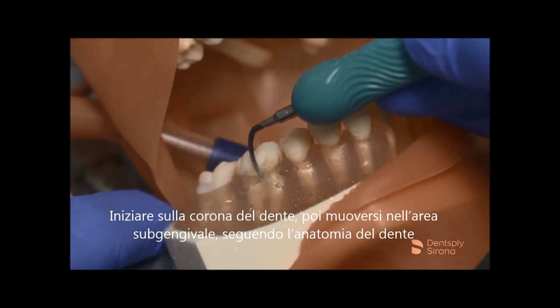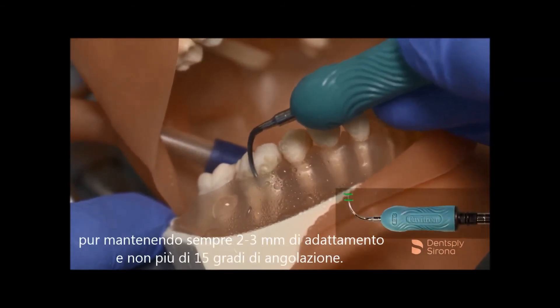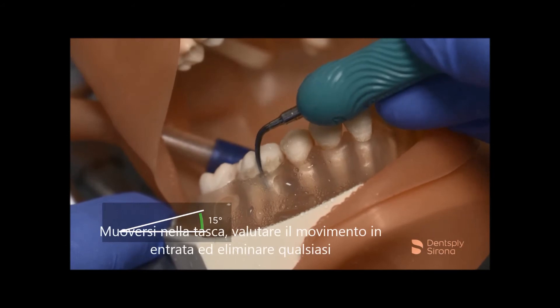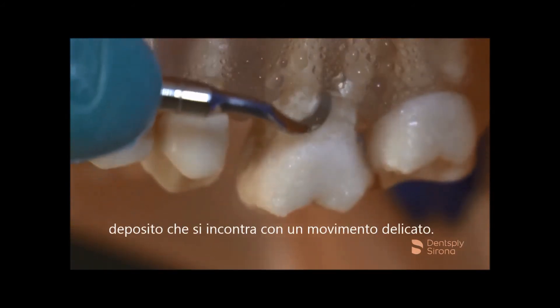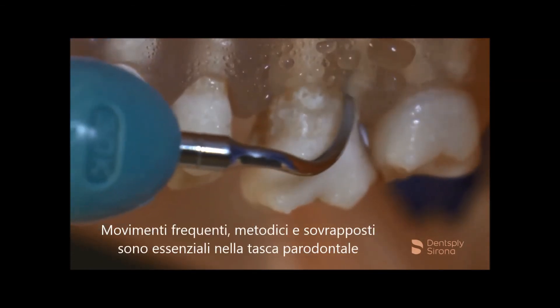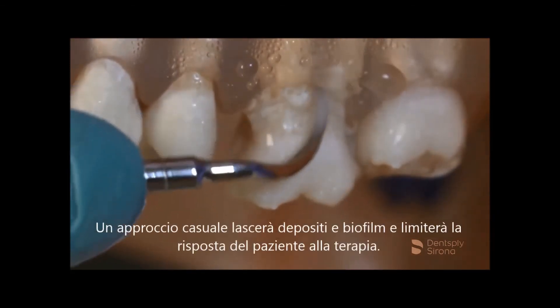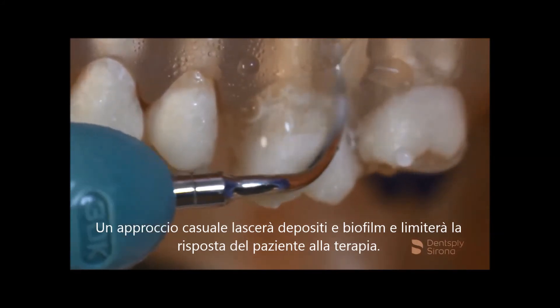Begin on the clinical crown, float subgingivally, riding the anatomy and clinging to the pellicle while always maintaining 2-3 mm of adaptation and no more than 15 degrees angulation. Navigating the pocket, assess while entering and engage any deposit encountered with a gentle tap. Frequent, methodical, overlapping strokes are essential in the periodontal pocket to detoxify and debride every square millimeter. A haphazard approach will leave deposit and biofilm behind and limit the patient's response to therapy.